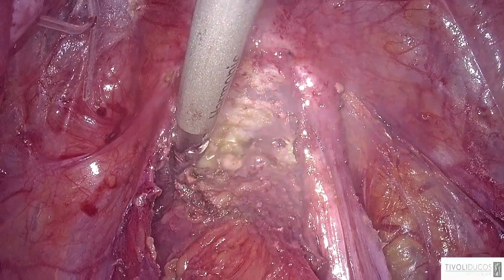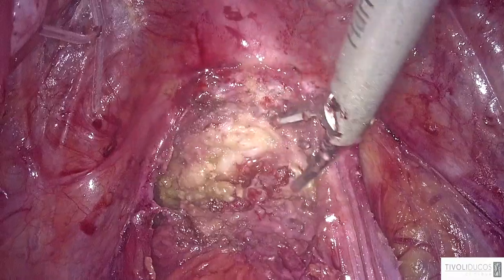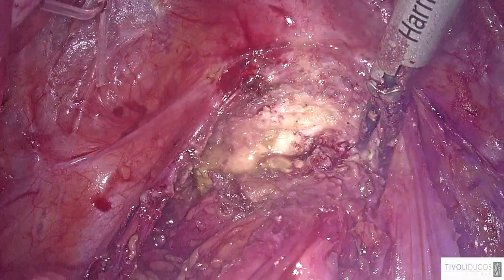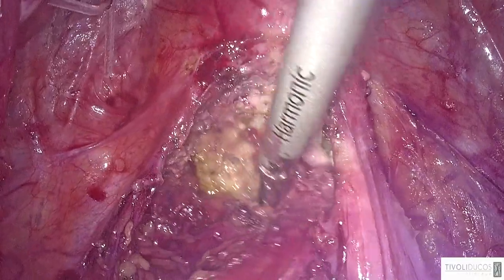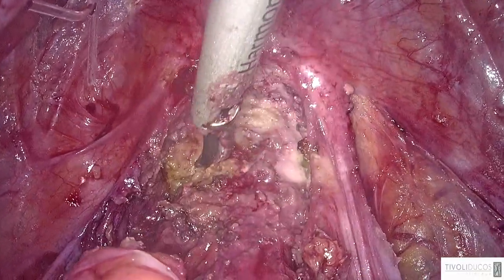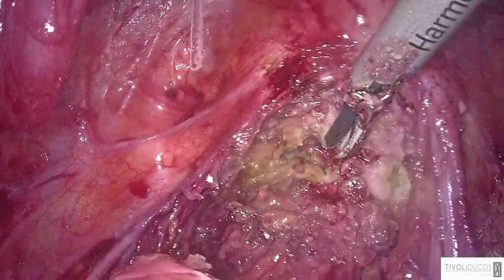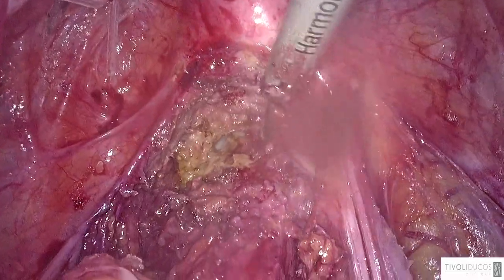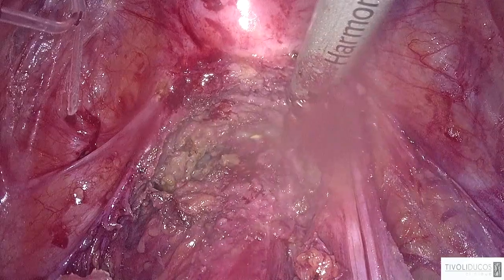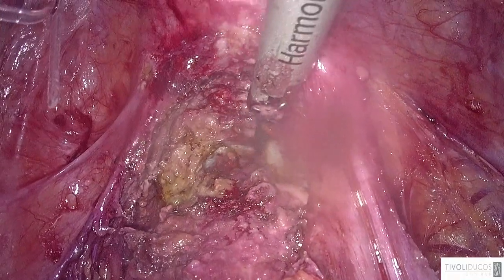But dissection is easier with this tip of this instrument, huh? It is sharper, and this helps me to dissect in these cases. How is the effectiveness of this type of instrument to clamp the vessels? Very similar to the previous one. Even though they told me it works better, I'm not very sure, or the difference is not obvious. It's not relevant for me. But the dissection is much more precise.